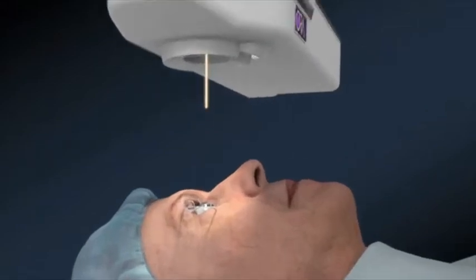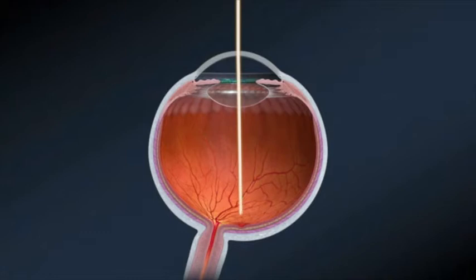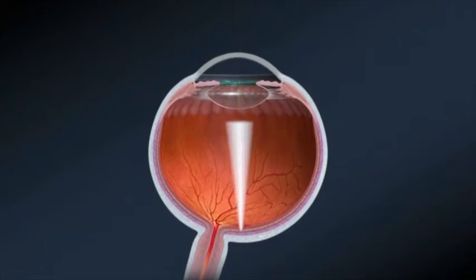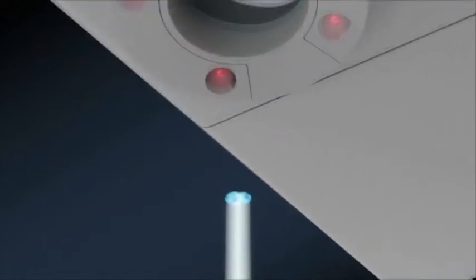Using state-of-the-art laser guidance, a narrow beam of light is directed into the patient's eye and is reflected off the retina. As the reflected light passes back through the optics of the eye, it produces a wavefront image.